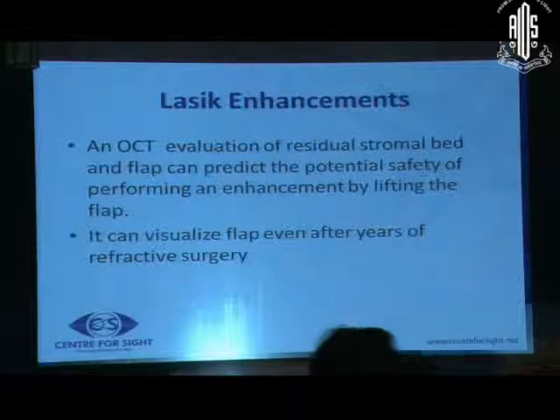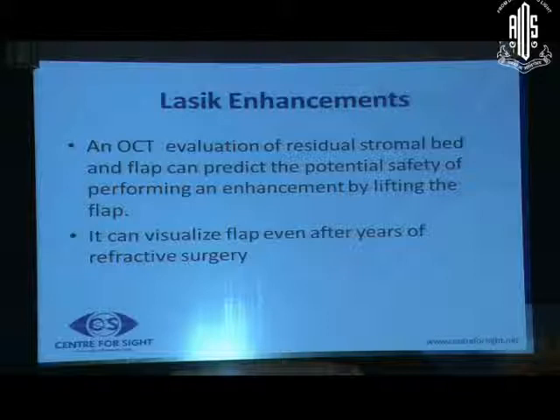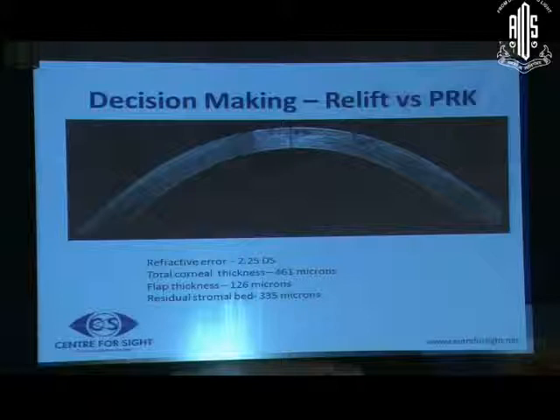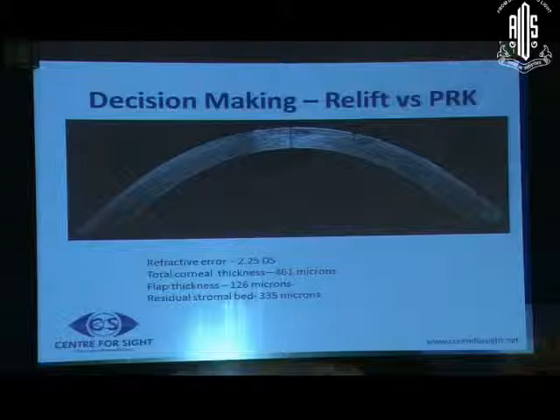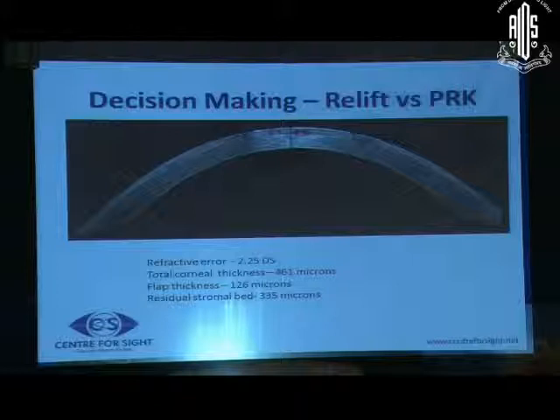Anterior segment OCT is also helpful in planning LASIK enhancements, as it can visualize the flap even after years of surgery. This patient had minus 2.25 diopters of refractive error 8 years after primary LASIK and wanted a re-correction. OCT measured the total corneal thickness at 461 microns, with a flap thickness of 126 microns, leaving a residual stromal bed of 335 microns. So we could safely proceed with enhancement by re-lifting the LASIK flap rather than doing PRK.